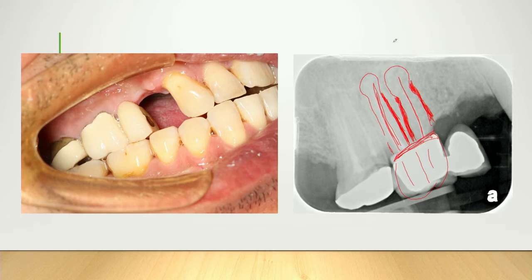What happens a lot of the time where people go wrong is you've got the tooth root fairly loose and you're thinking, oh, it's almost loose, I'm almost there, okay? And you've put a little bit too much force, and what's going to happen is that it's going to fracture there. So when you notice that it's bulbous, do not be fooled by movement of your root, because the root will be very mobile, but it just won't come out.